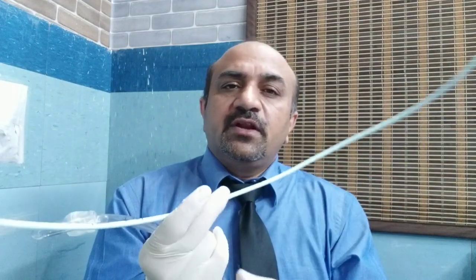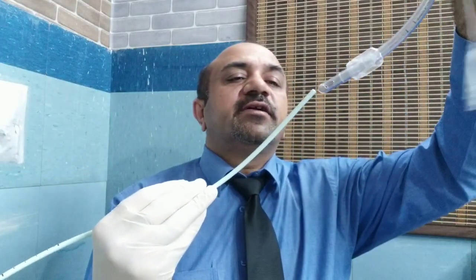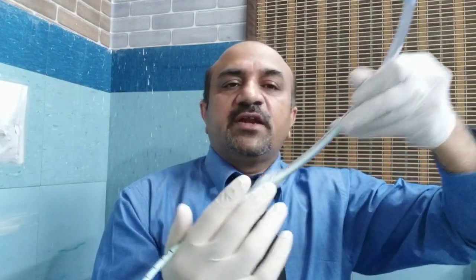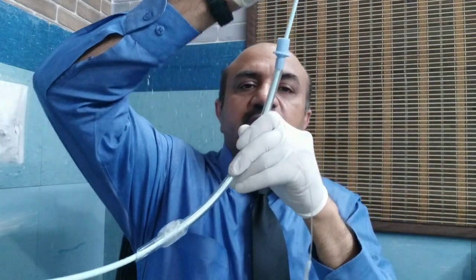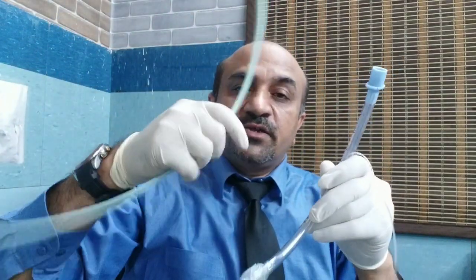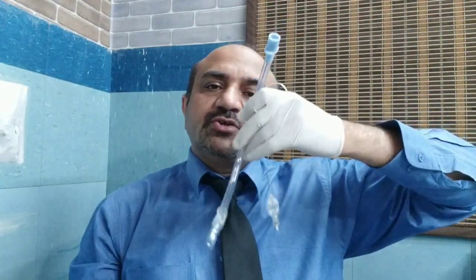Then you hold it this way, and using the Seldinger technique, you can pass the endotracheal tube through it all the way down to the patient, and once it is there, you can remove the bougie. So this helps in difficult cases, and the Seldinger technique is also what we use when we are passing central lines or the triple lumen and double lumen lines.